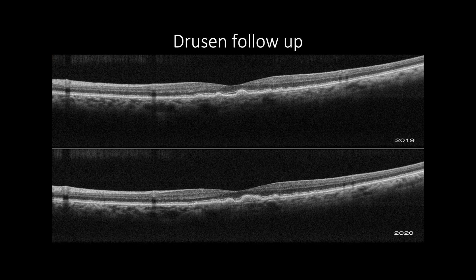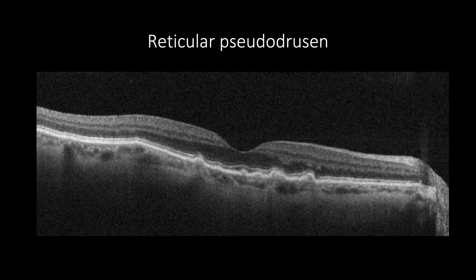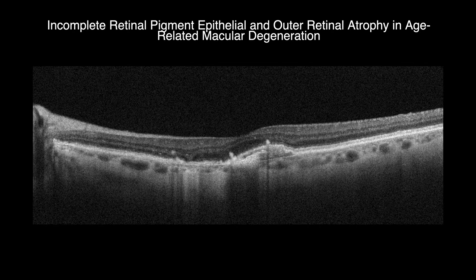OCT is useful to monitor the changes in drusen size, content, and quantity, as in this case where drusen have increased in size within 12 months' follow-up. When drusenoid material is accumulated in the subretinal space, it forms reticular pseudodrusen that can be located between the ellipsoid zone and RPE, alternating or breaking the ellipsoid zone contour, which may hold a prognostic factor for development of advanced AMD.